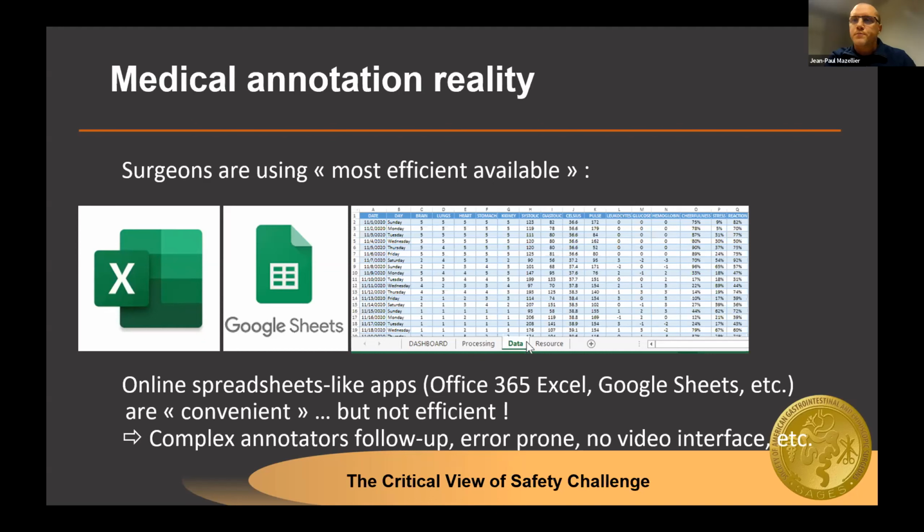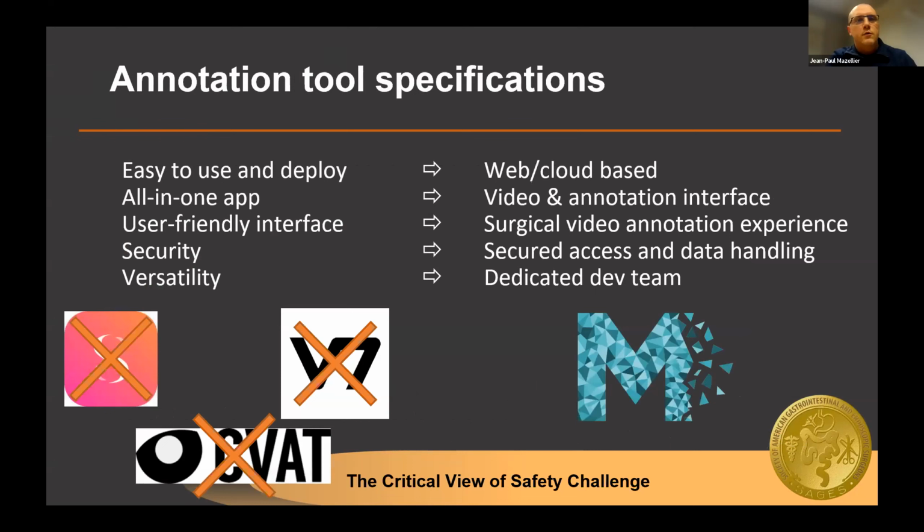And unfortunately, this could be a deal breaker to get a very high quality data set. And this could really reduce the impact of the challenge we want to take up. So we want to have some specific annotation tools, but they should fulfill some requirements.